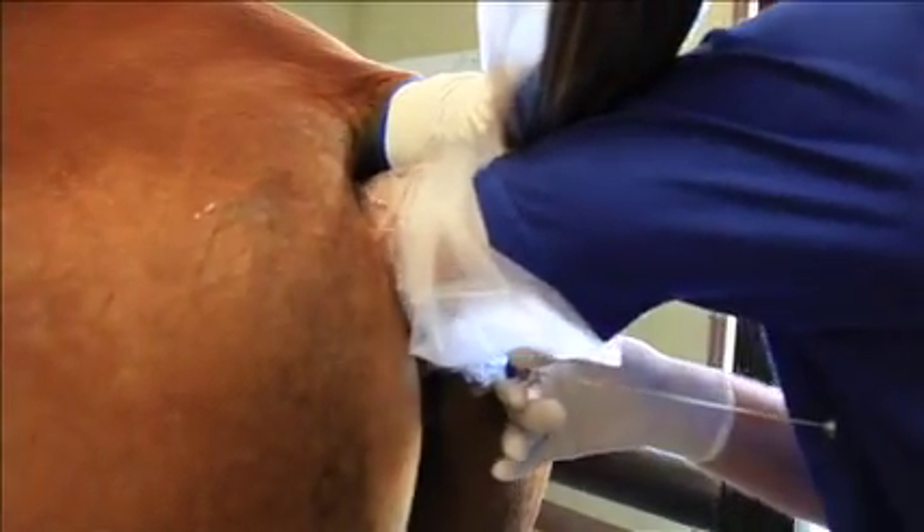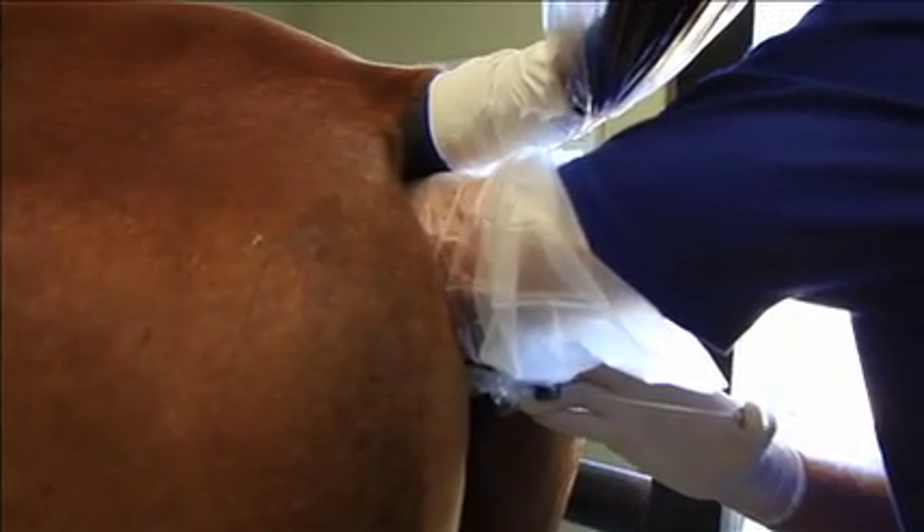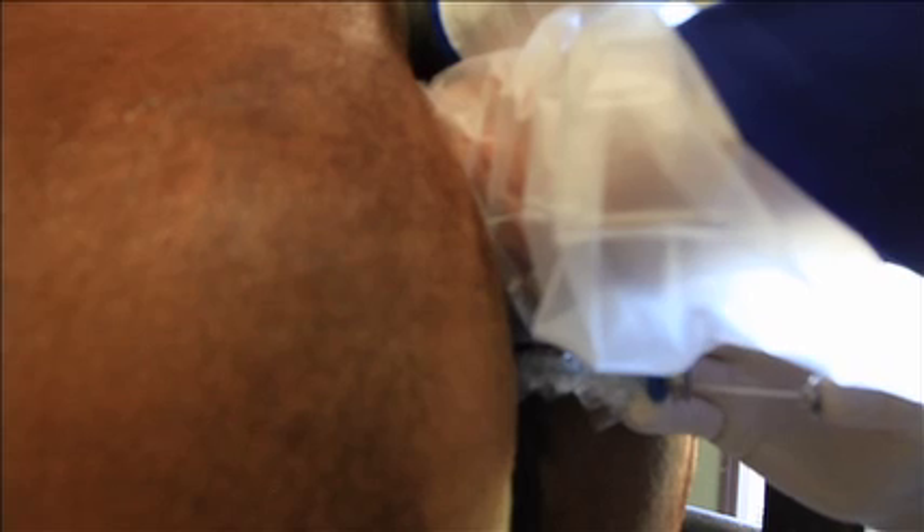So now I slowly deposit the embryo. I want that column of fluid and the column of air to push very slowly so that I'm sure the embryo leaves the straw. And there we have it.